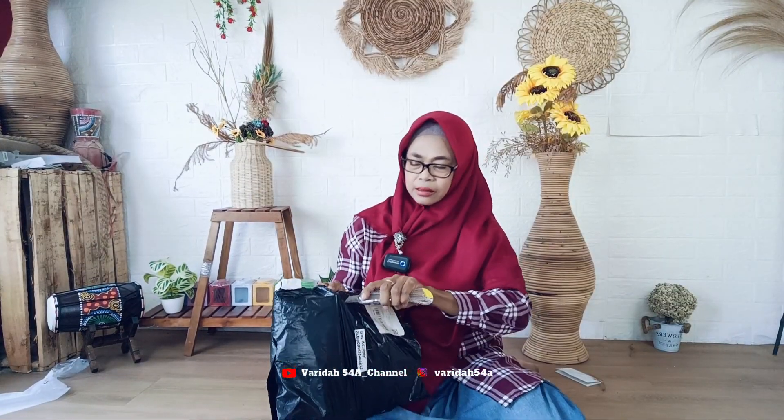Baiklah teman-teman, saya mau unboxing, saya buka dulu ya. Ini dia — Stella Orthopedic Lumbar Sacral, bisa dibaca ortosis korset. Jadi ini adalah korset kesehatan.